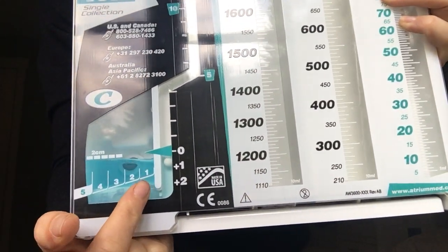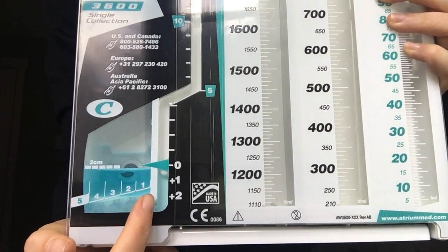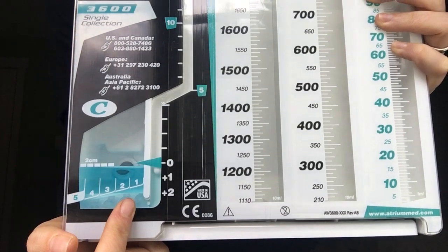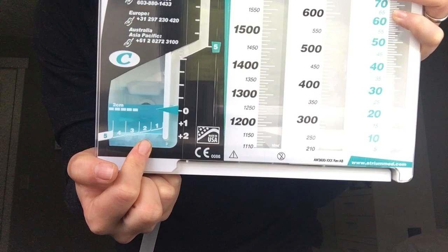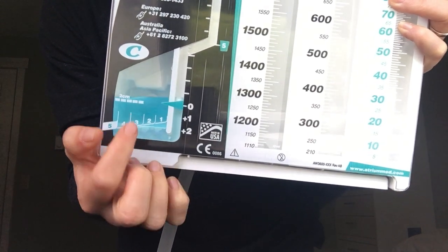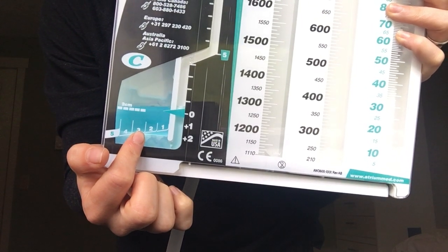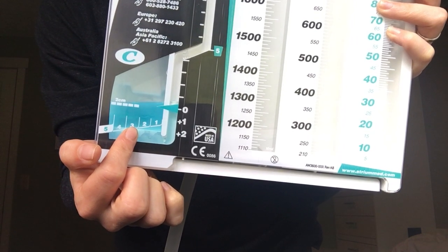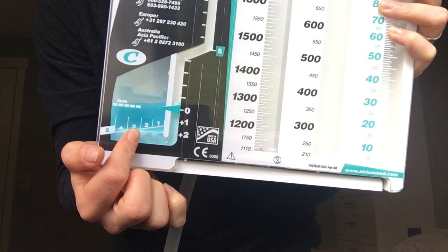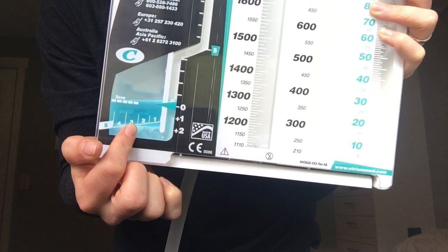You can see that there are numbers along here, and they determine the amount of volume of air leak that you'll see. When your patient is off suction is the easiest time to check for an air leak. You'll look for bubbles in this chamber, not just turbulence, but bubbles that pop at the top. Sometimes you'll see them when they just breathe, and sometimes only when they cough. When you only see it with cough, we call that an intermittent air leak. When you see it when they're just breathing, we call it a persistent or consistent air leak.